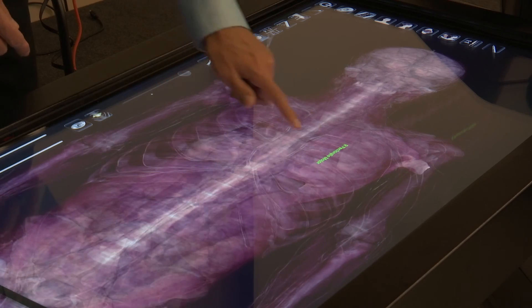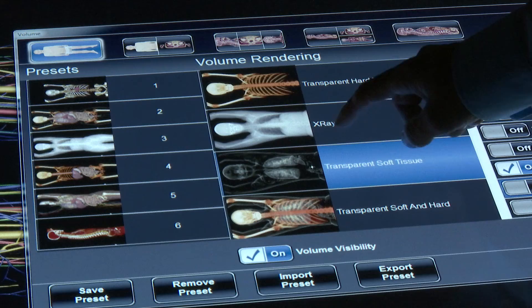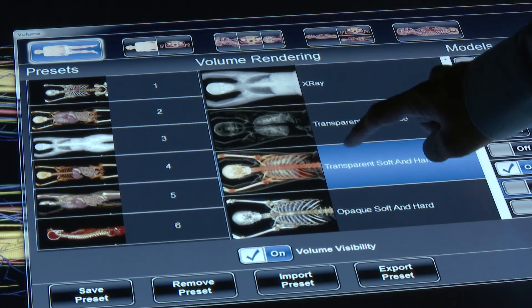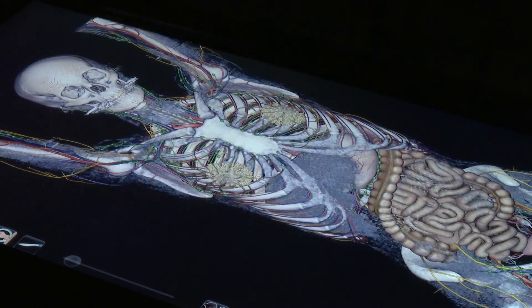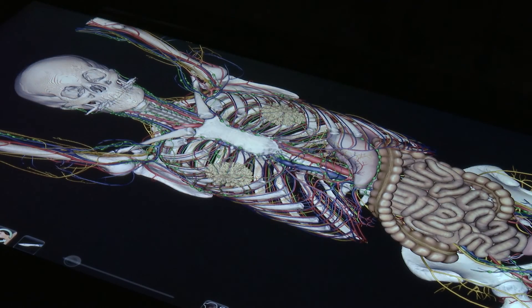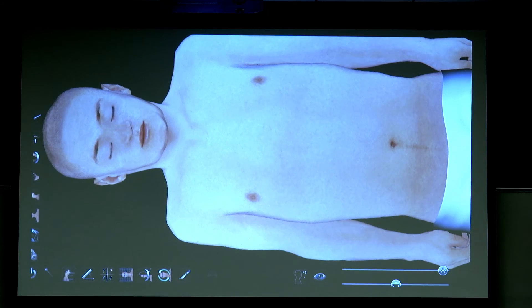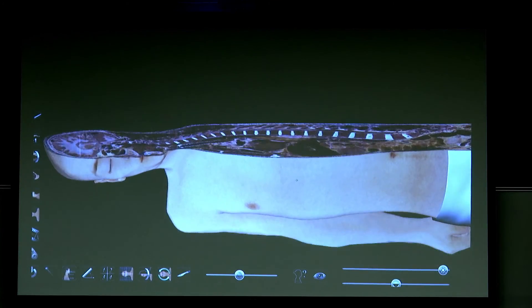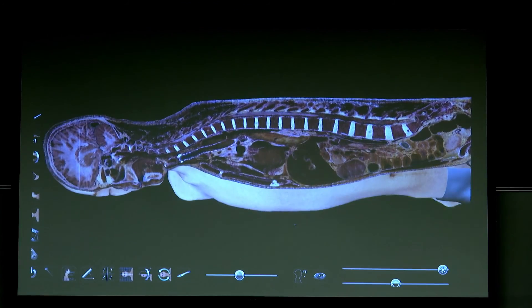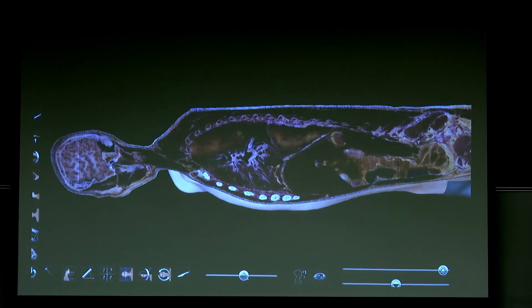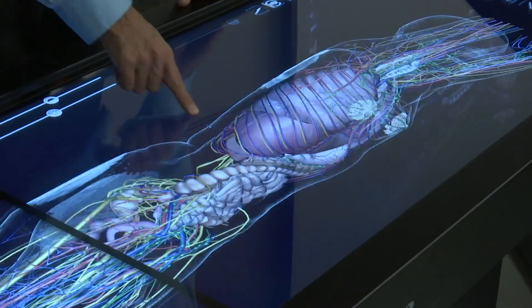We're able to utilize male specimens, female specimens. We're able to isolate the different systems of the body, eliminate systems of the body individually, or we can actually make slices through the body so we can allow the students to see where the structures are located in relationship to each other.